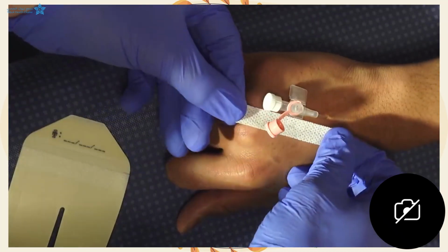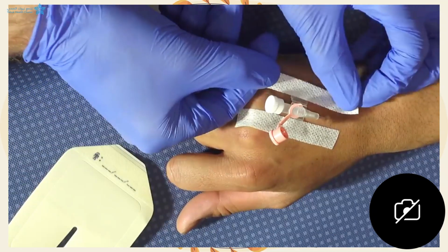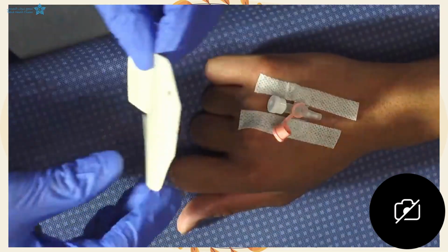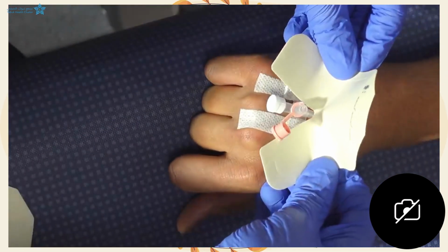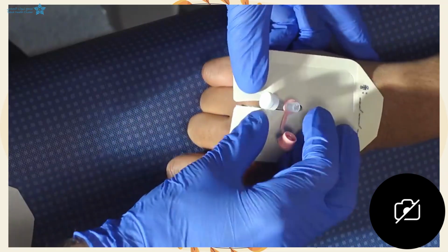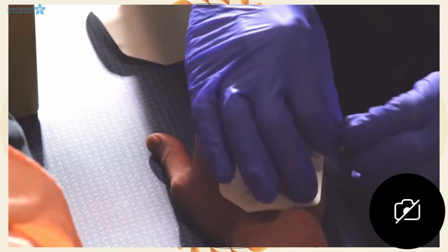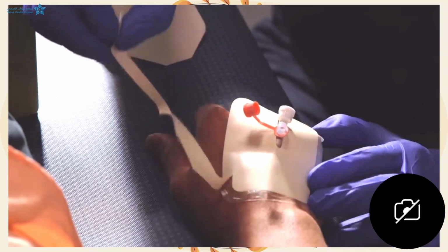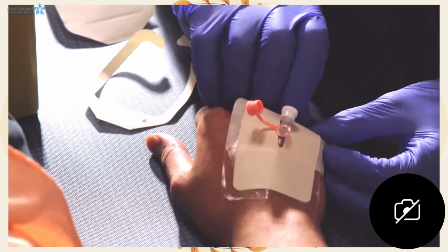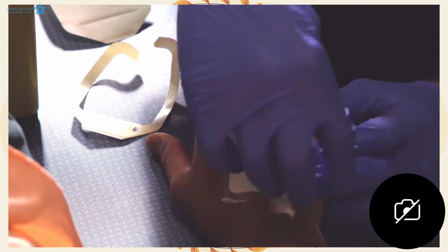At this point, we now want to tether down the cannula, putting the first strips over the wings, holding it in place. That keeps things nice and secure. Then we're getting the main Tegaderm, applying over the insertion site, so that way things have been covered and it reduces the risk of any infections to that wound site. We're coming round again to touch across the front of the port. We're going to remove the outer part of the Tegaderm, saving the outer part which contains the date, and we'll remove the overall part of the film.